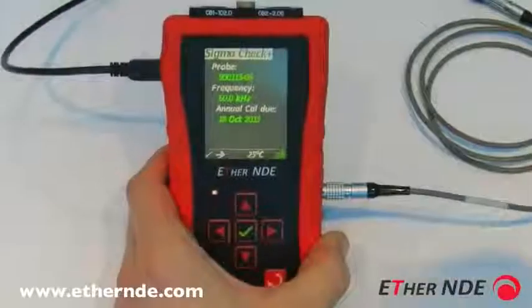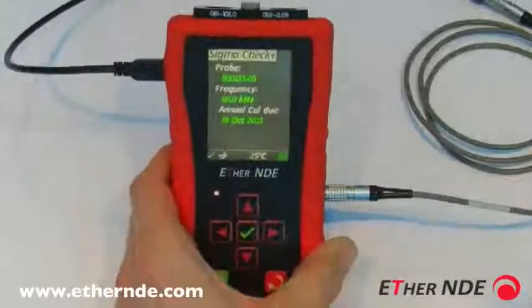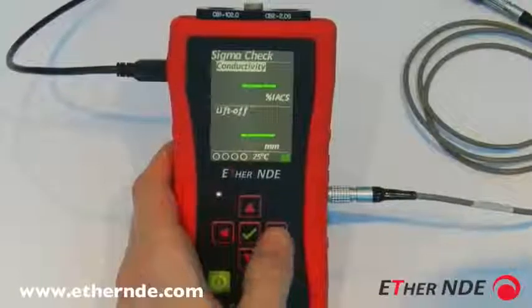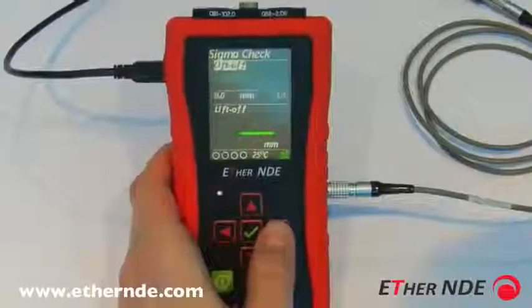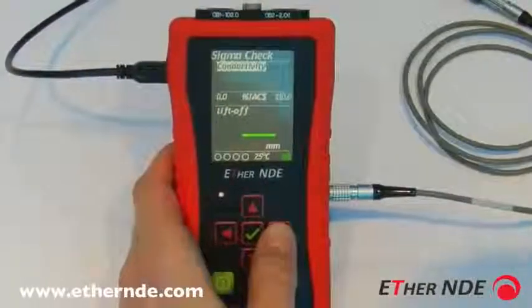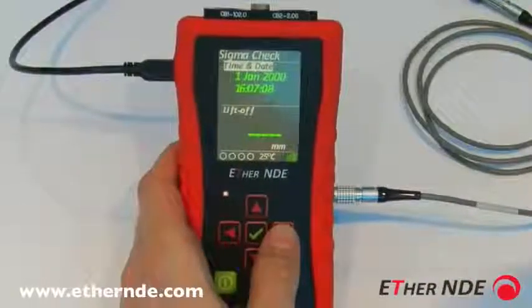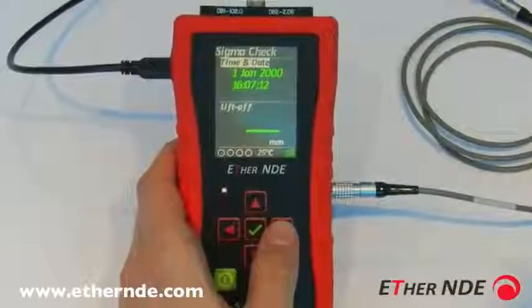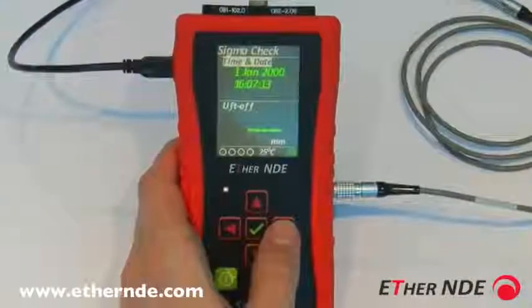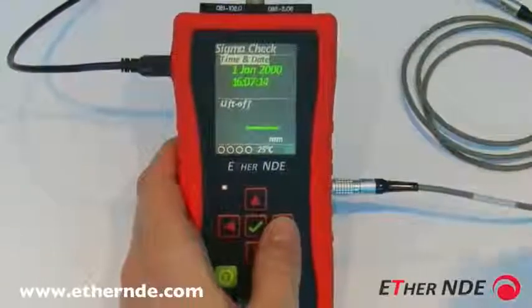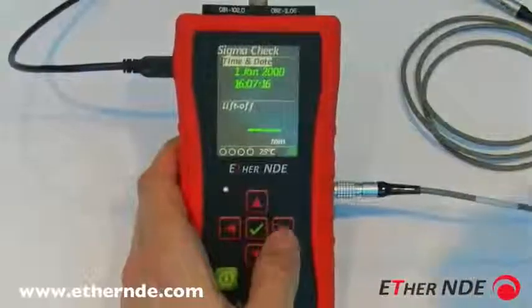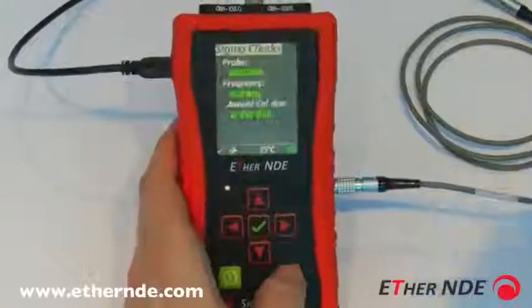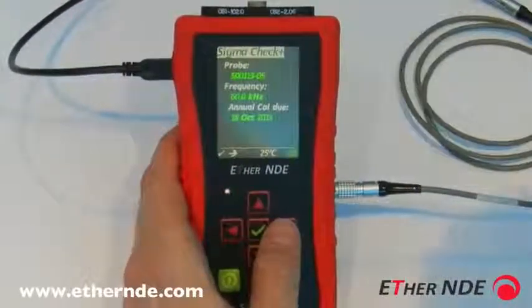Changing the time and date on the Sigma Check: first go into the reading screen and scroll through the available displays. You can see there is a time and date display, currently incorrectly set to the 1st of January 2000 at 4 minutes past 7. To change that value, return to the home screen.